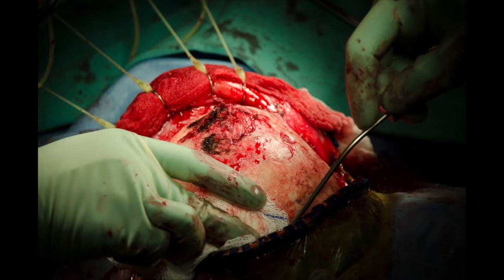If pericranium is being harvested, this layer is left down while the scalp is retracted forward, using blunt dissection and Metzenbaum scissors to separate the layers. Then once the scalp is fully retracted, the pericranium is sharply cut posteriorly and along the superior temporal lines laterally, then mobilized as an intact sheet with an anterior vascularized pedicle. The pericranial graft is protected with wet white sponges until needed later in the case.